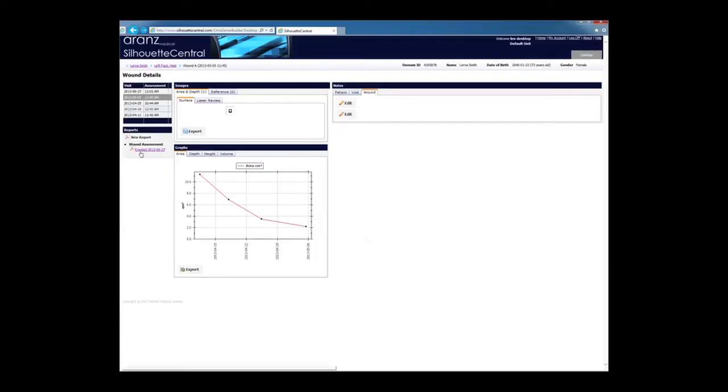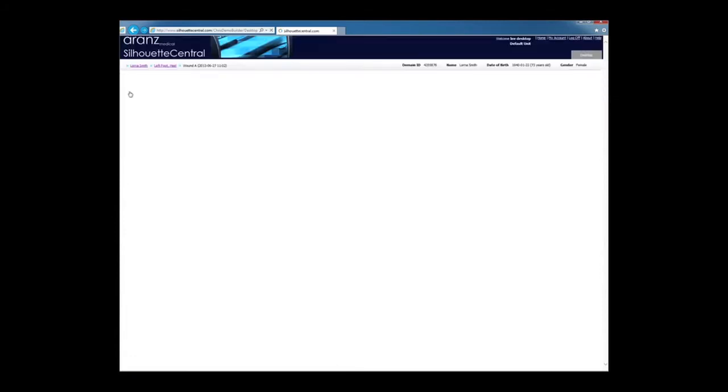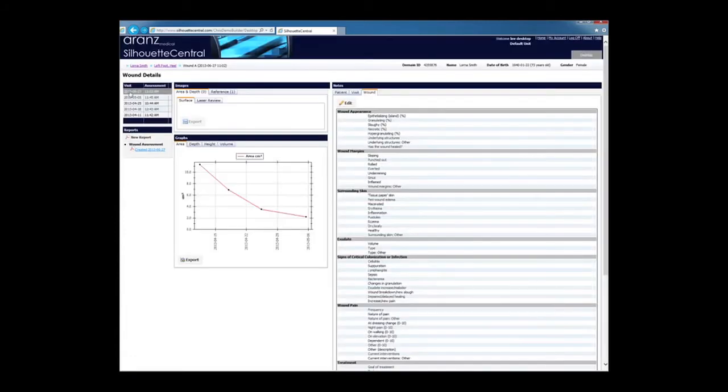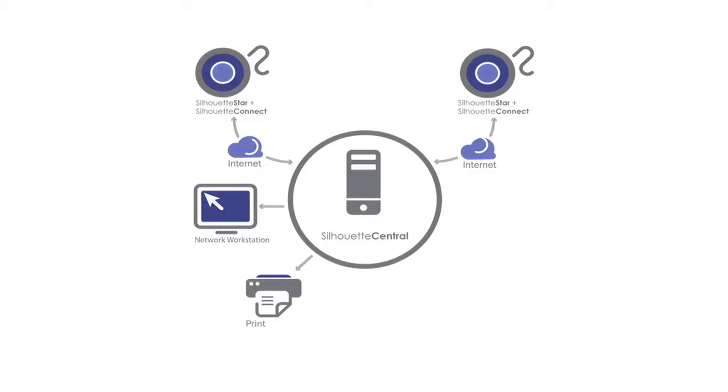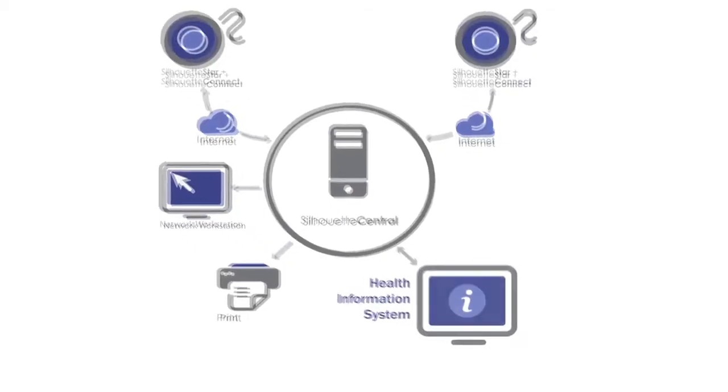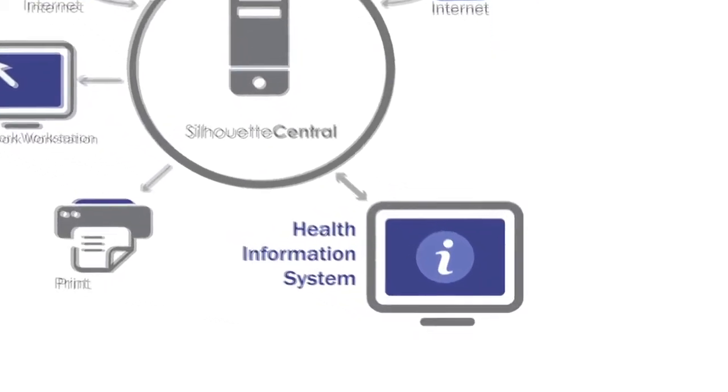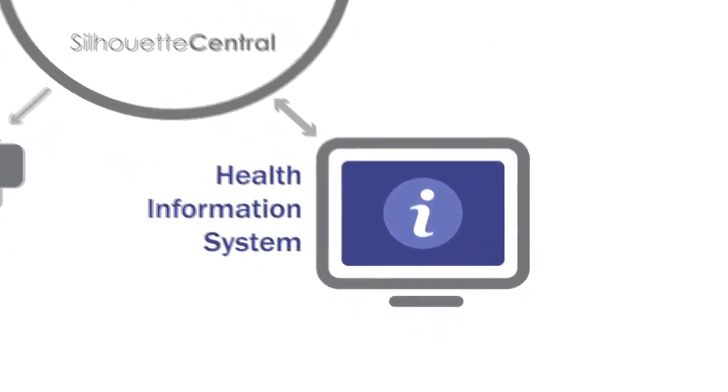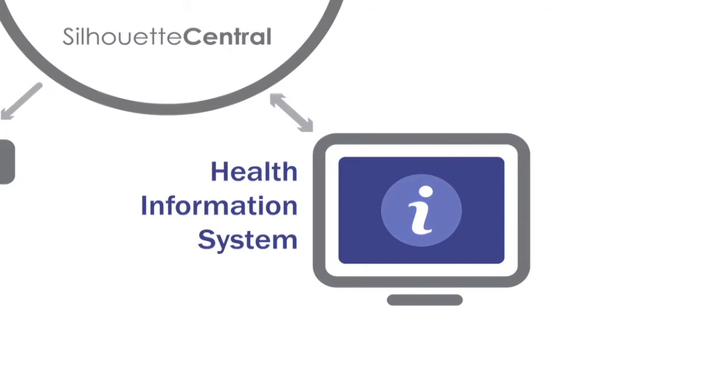The Silhouette Central database provides a clinical wound management overview. It helps clinical managers to monitor the wound care effort and identify priority cases. Silhouette can be integrated into electronic medical record systems.